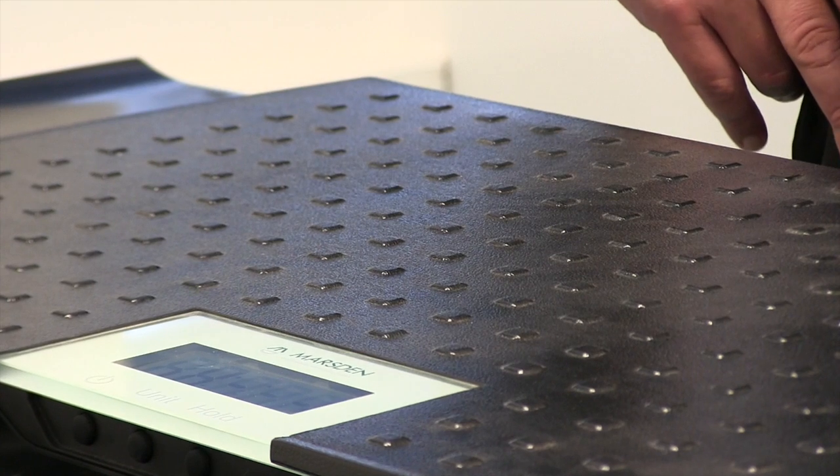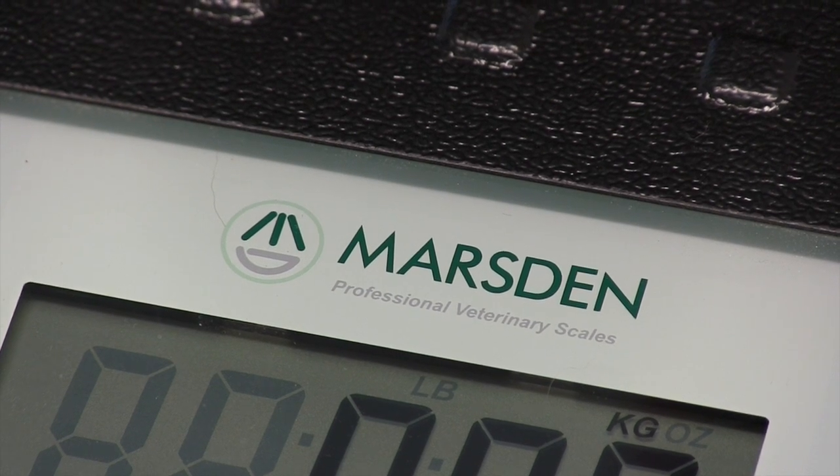Hi, I'm Des McCullough. I'm here at Springfield Veterinary Practice in Rotherham to demonstrate our V100 medium sized pet scale. The battery powered V100 is primarily used in veterinary practices, but also used by pet lovers and breeders alike.